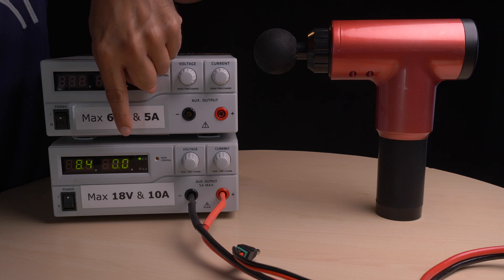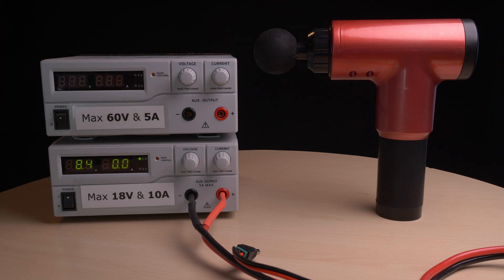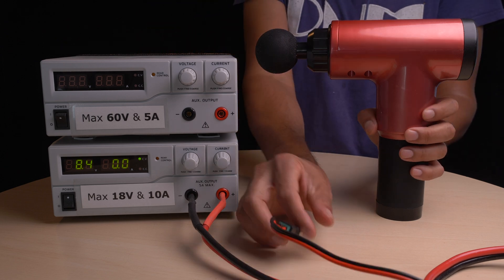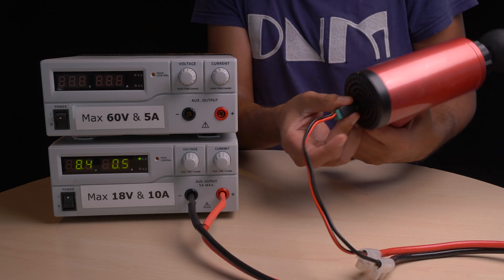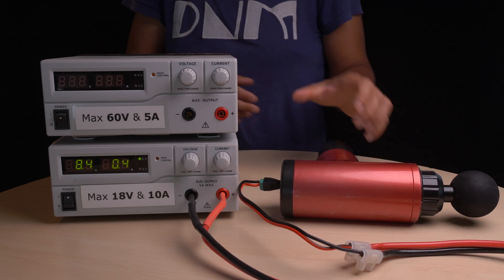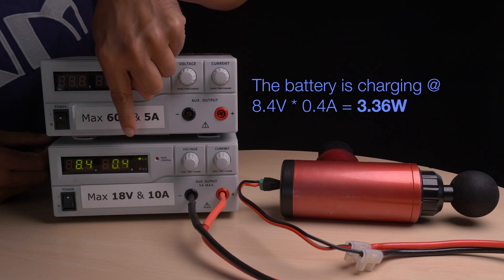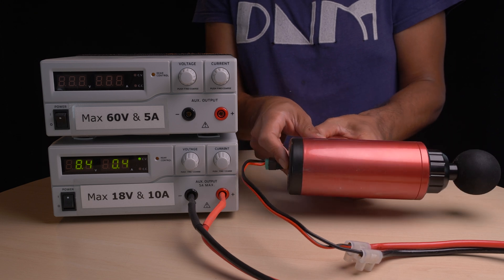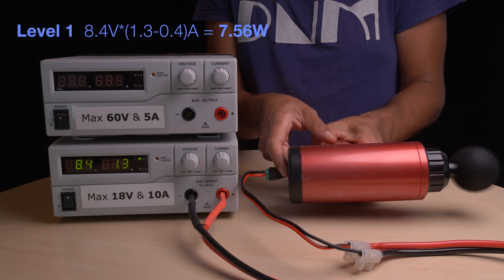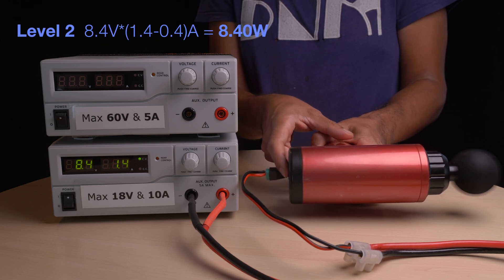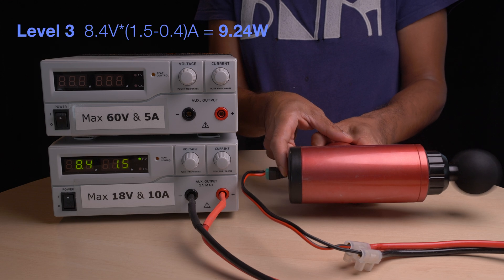This power supply is set on 8.4 volts. It can deliver 10 amperes, but it's delivering 0 at the moment, because nothing is connected. Now the power supply is connected to the massage gun, and it's charging it with 0.4 ampere. Times 8.4 volts is 3.36 watts. This now is how to calculate the power use on all six levels, excluding the 0.4 ampere that goes to charging.